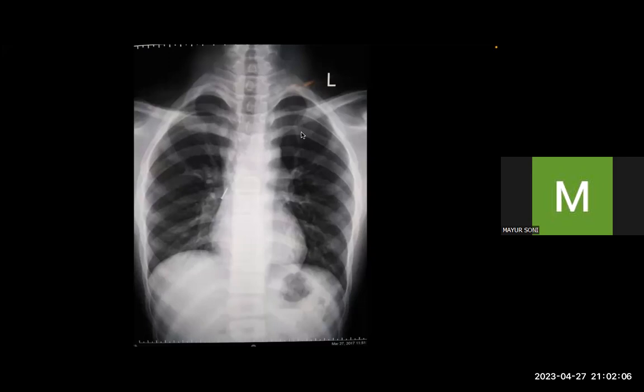Organization of the foreign body in the bronchus, so it will be difficult removing it. A lot of bleeding may be there. So bleeding, granulation and bleeding and loss of vision. Yes. Another thing, look at the foreign body and tell me another problem that you might have.